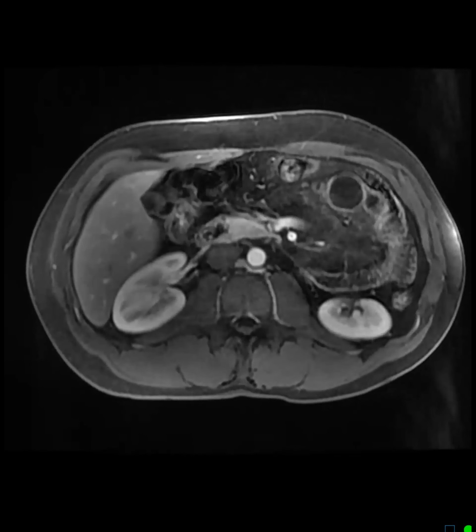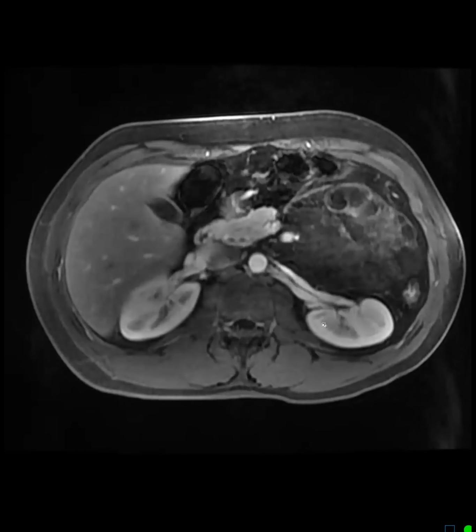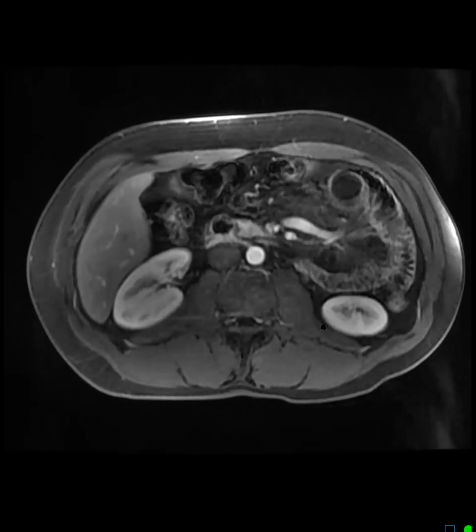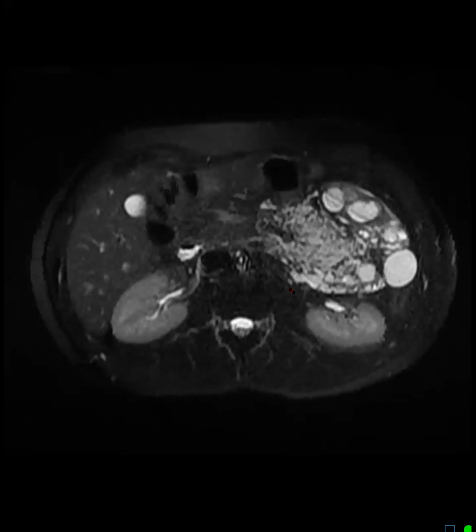Do you agree? I do think though that something happened to that lateral part, and he said he was vomiting and things, so maybe some acute thing happened. I read recently, last week I presented on lymphangioma, that they can hemorrhage and can be more complex. So maybe there was some kind of acute inflammation or hemorrhage. Oh yeah, actually, can you show the T1 pre? Is there any blood products you see over there?